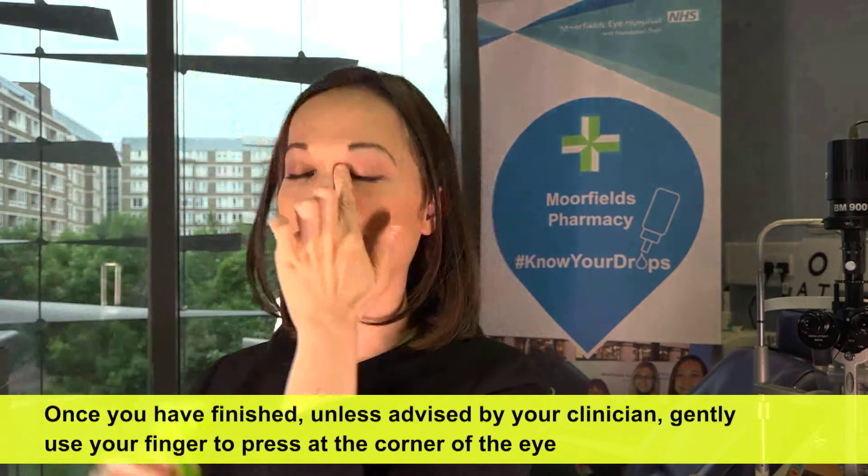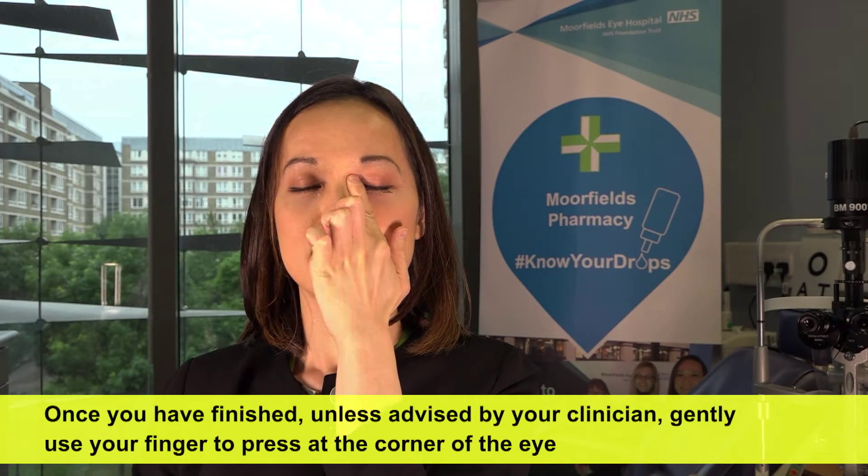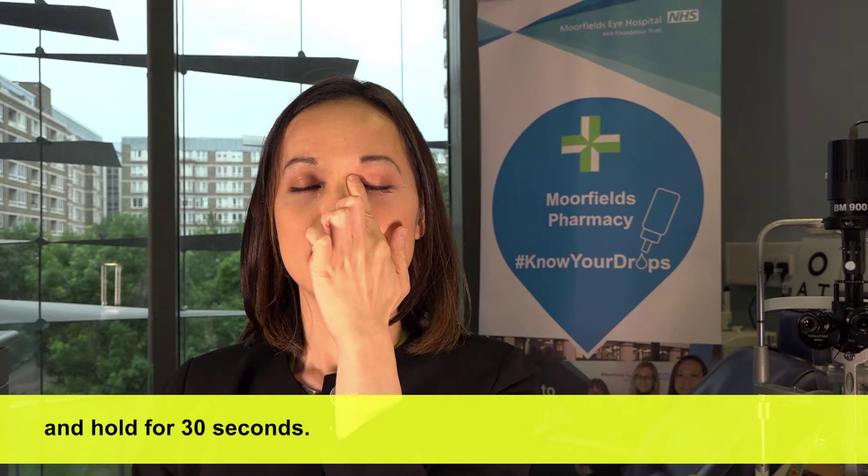Once you're finished, unless advised by your clinicians, gently use your finger to press at the corner of the eye and hold for 30 seconds.